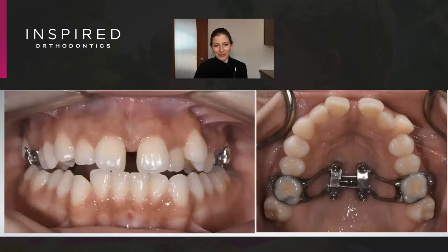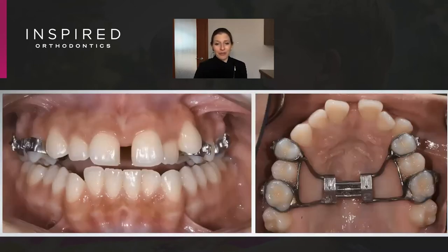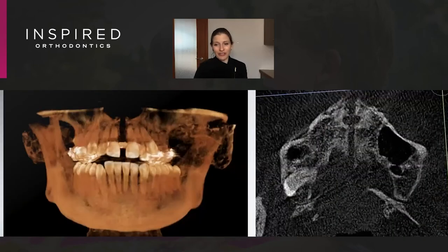We have to think a little differently here. Anatomically, those sutures are now open, so we should have less resistance to our appliance. We went ahead and used a tooth-borne expander. We did get some secondary tipping, but we went ahead and widened that upper arch, and you can see that nice parallel opening.